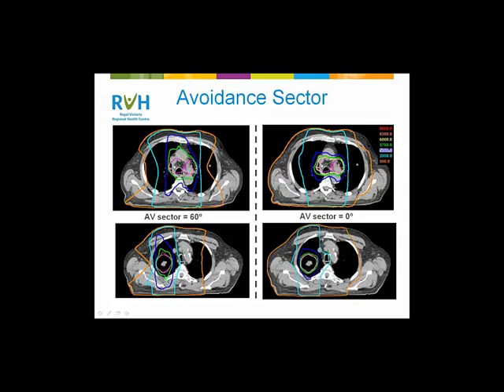So we've been using total lung. To the comment I mentioned a while back, it would be helpful if we had some consensus guidelines so that everybody would do this the same way and we could build a better database. But in the meantime, that's what we're stuck with. The RTOG studies on these populations of patients for IMRT are few and far between. There's a couple of them, and those tend to lead into consensus guidelines for how structures should be contoured. We'll stay tuned to that and see what comes from it.